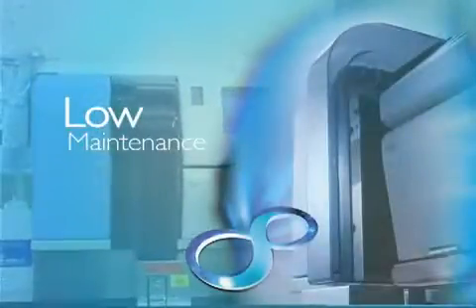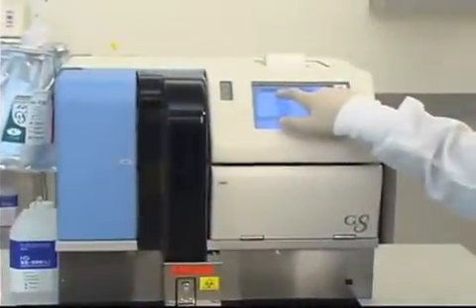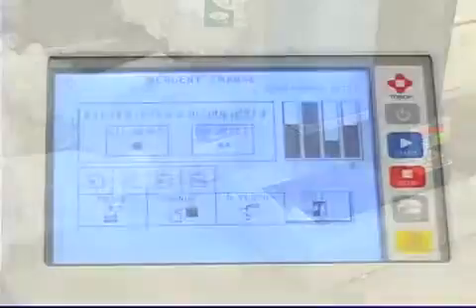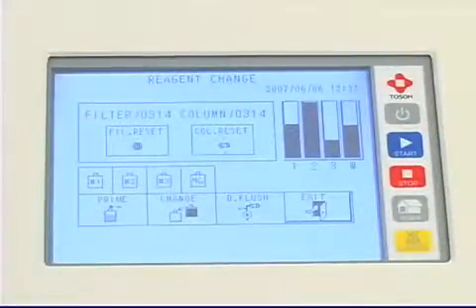Maintenance on the Tosoh G8 is minimal and requires only a few minutes per day of operator time. The operator checks reagent levels, filter, and column counts. No other maintenance is required.